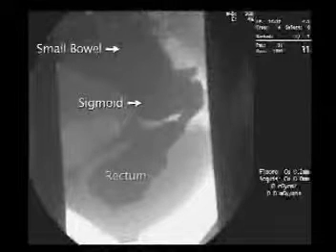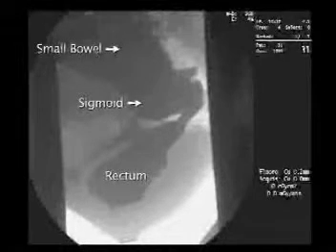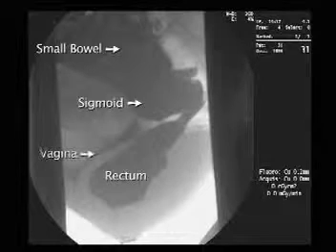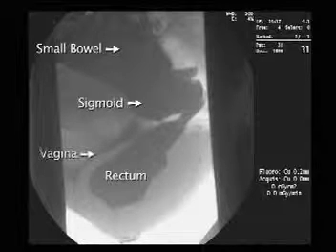The patient is given oral contrast to opacify the small bowel, liquid barium to distend the sigmoid colon, and rectal paste to outline the rectum. A contrast-soaked tampon is inserted in the vagina. The patient is asked to strain.